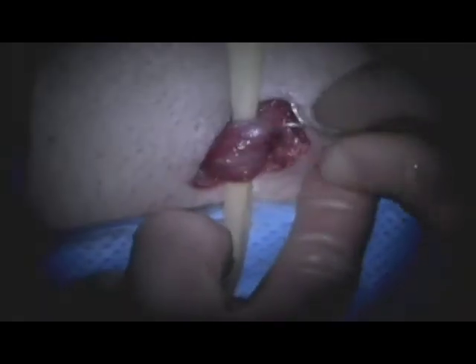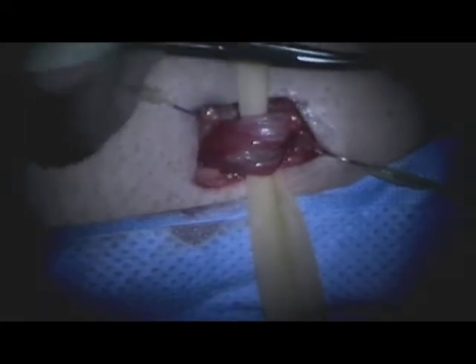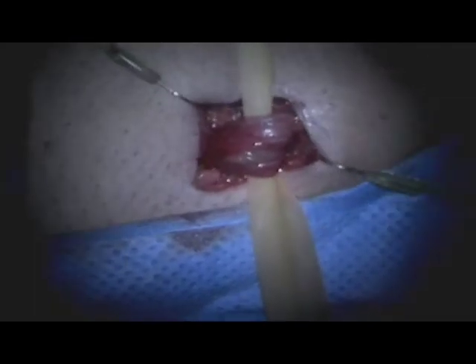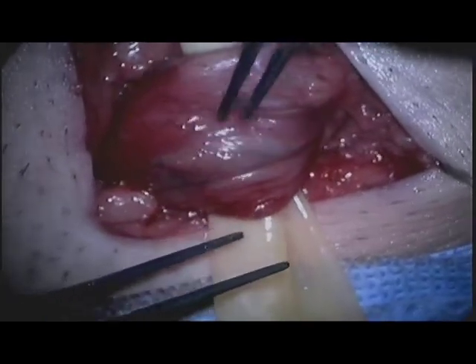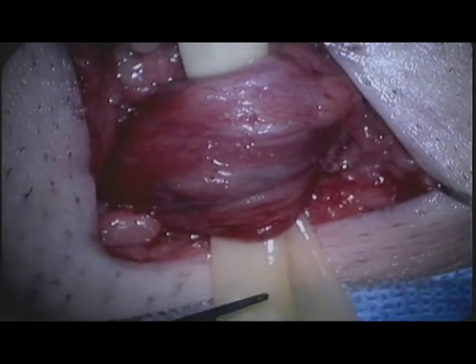The Penrose drain is then clamped to the drape to allow adequate elevation of the spermatic cord into the surgical field. For atypical incisions, such as the groin incision, additional retraction may be necessary for adequate exposure. The microscope is then docked at the patient's bedside. The external and internal spermatic fascia is then opened using electric cautery.